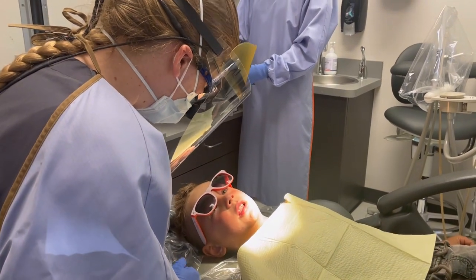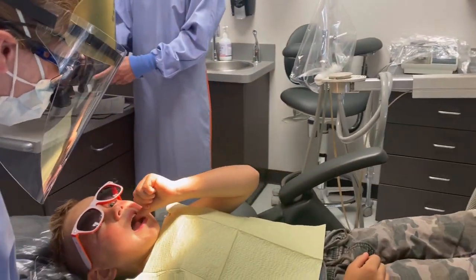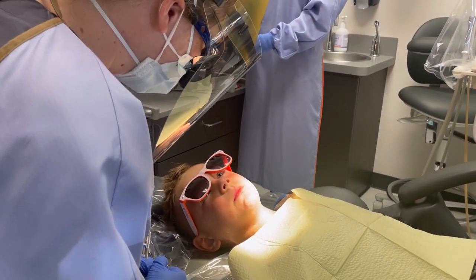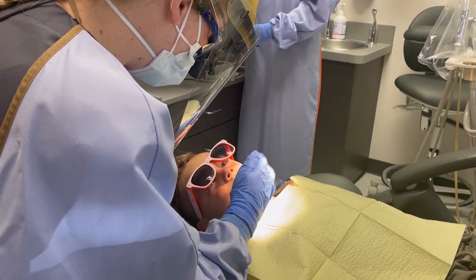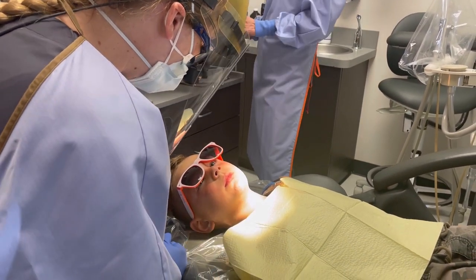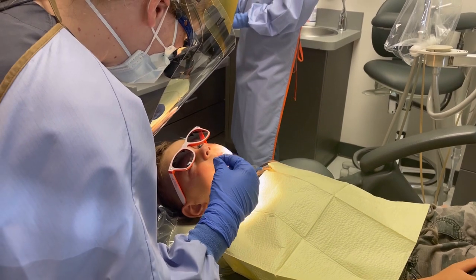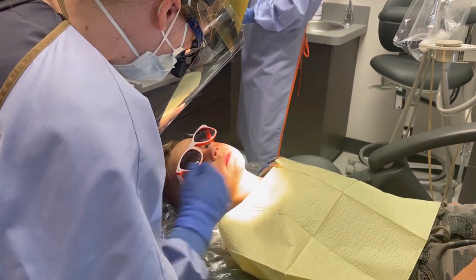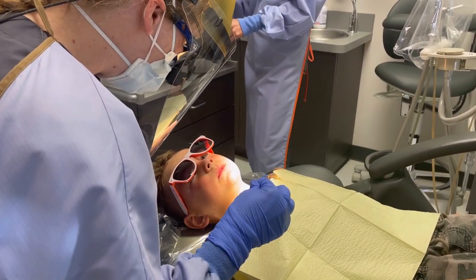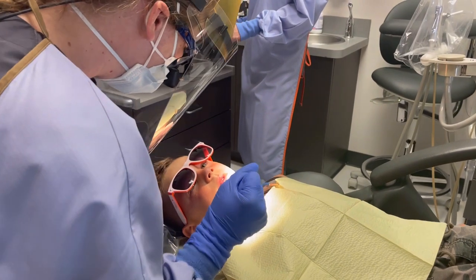But I think we can take care of it with a filling — which means I'm just going to clean out the cavity from your tooth and then put a material in there. It's kind of like a hard tooth material. This one is actually going to be tooth-colored, and it just goes between the teeth, so you won't even notice it. We give that tooth some sleepy juice so it takes a nice little nap, then I use a little spinny brush to clean all the cavity and sugar bugs out of the tooth.